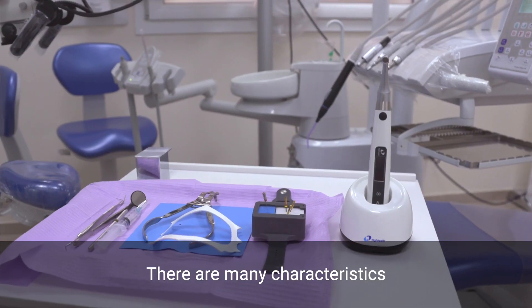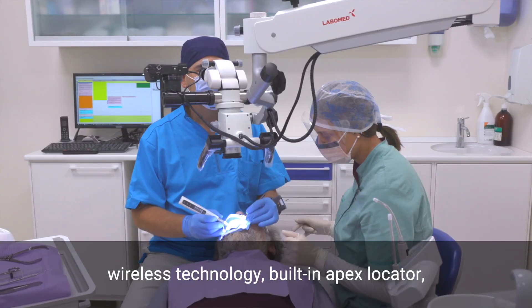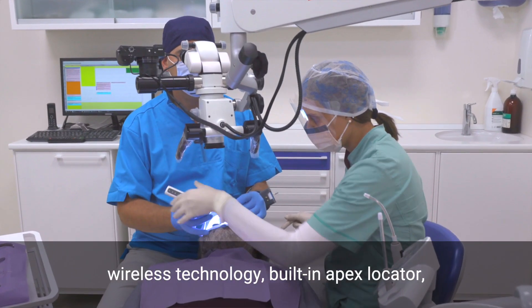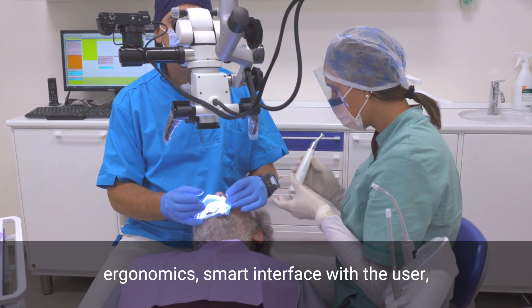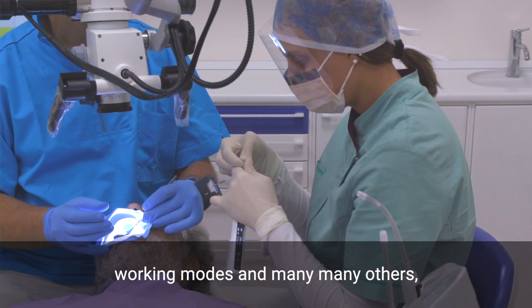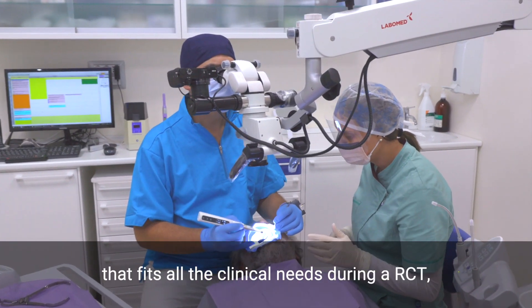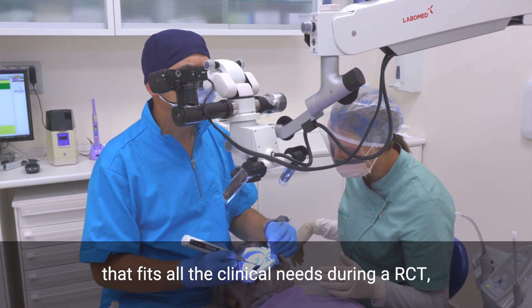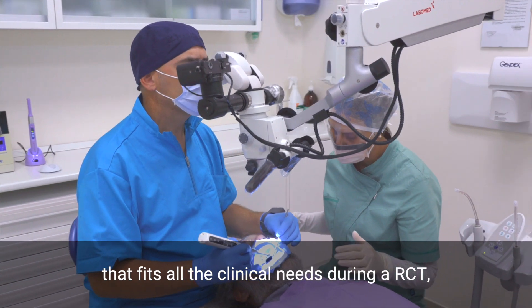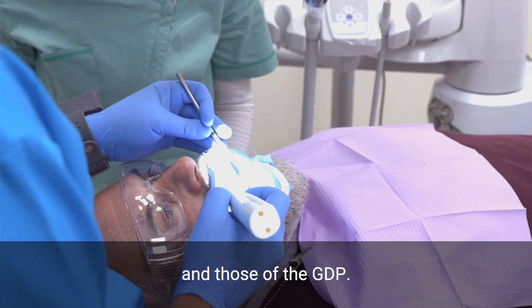There are many characteristics that make this Endomotor a special tool in the market: the wireless technology, the built-in Apex Locator, ergonomics, smart interface with the user, working modes and many many others. The list is really long and the result is a device that fits all the clinician needs during a root canal treatment, both those of the expert operator and those of the general dental practitioner.